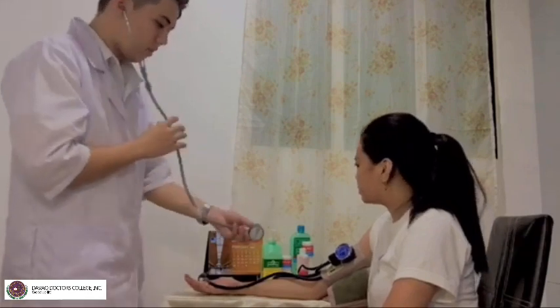Okay. So now we need to place the bell side of the amplifier of the stethoscope over the brachial pulse site, because blood pressure is a low frequency sound and it's best heard with the bell-shaped diaphragm.